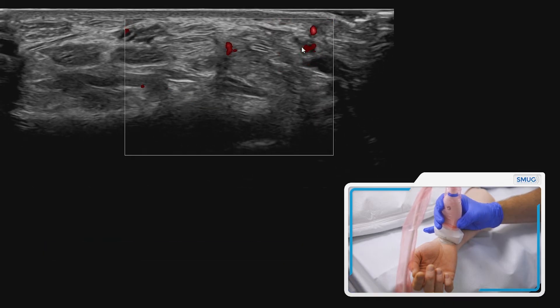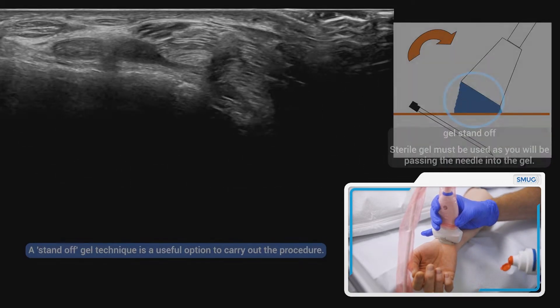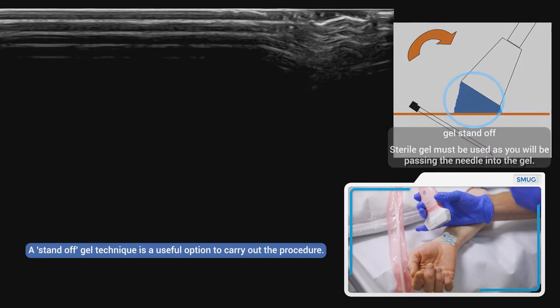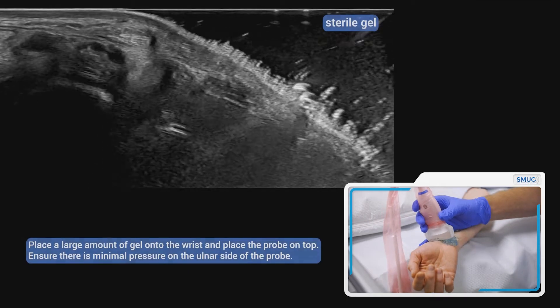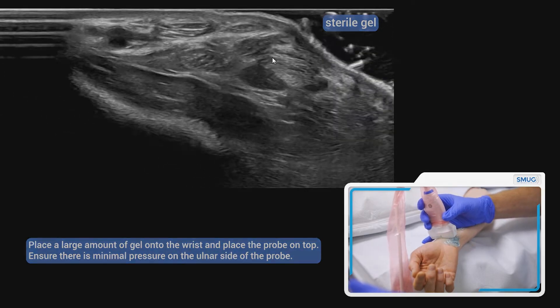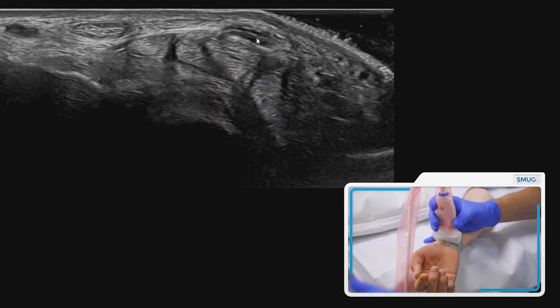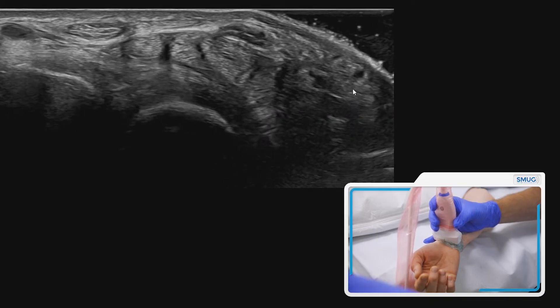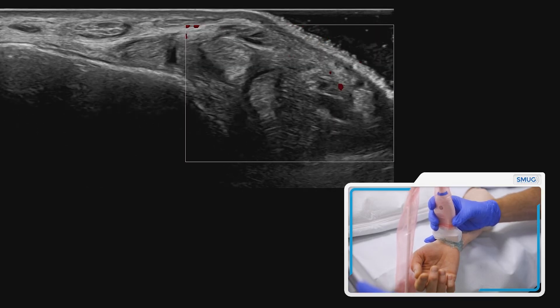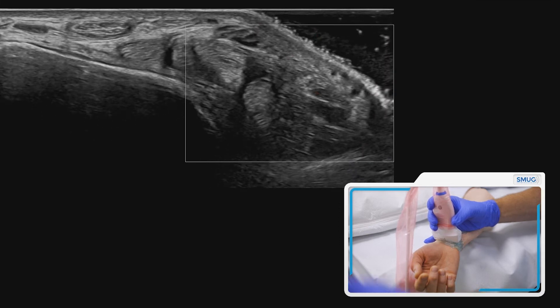I'm going to show you a technique called the standoff technique, which I find really useful particularly when doing a hydrodissection. If we apply lots of sterile gel to this area, we can then get a view where we can see the median nerve — this structure here — and also the artery. If you're unsure, just pop your Doppler back on and there you can see the vessel, confirming exactly where the arteries are.